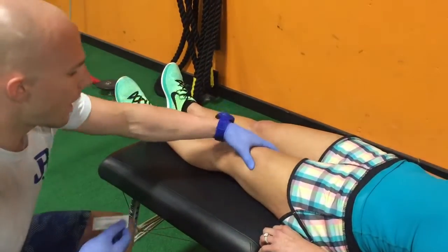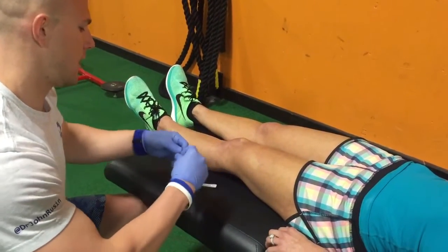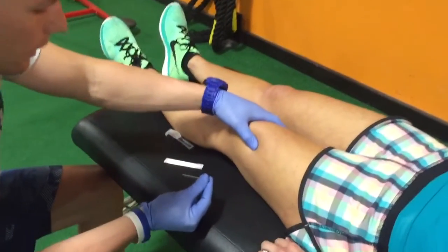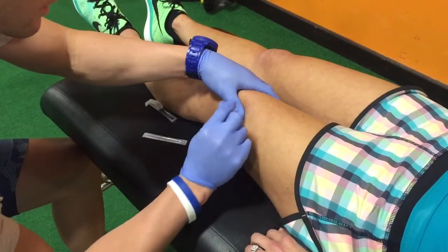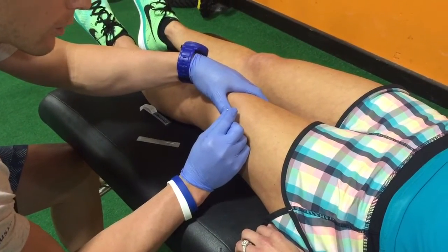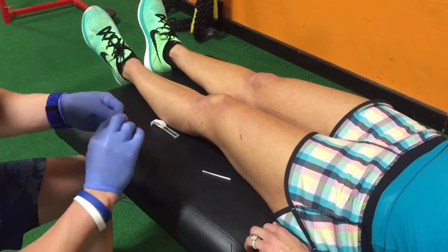I'm going to be palpating a point — it's pretty tender there — and taking out the dry needle, palpating that same point, and then inserting. We're going to drop this deep, get it into that trigger point, and actually drop deep to the bone. That's the vastus lateralis, the most lateral quadricep muscle.